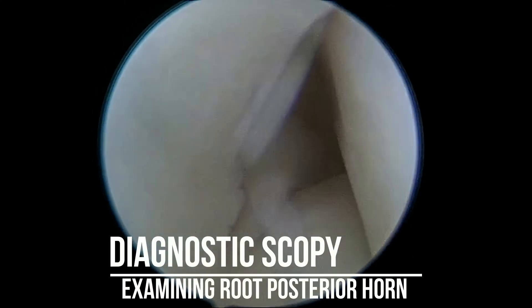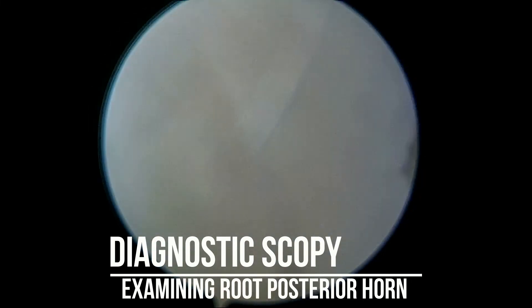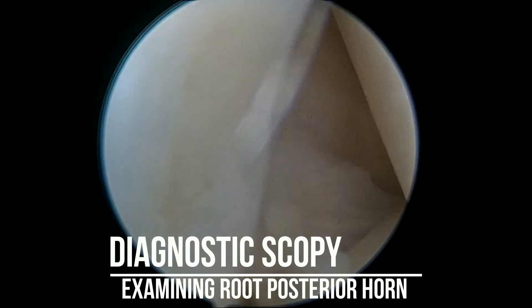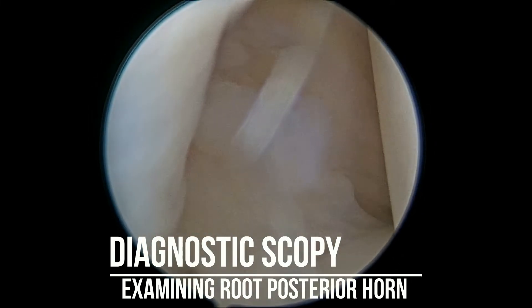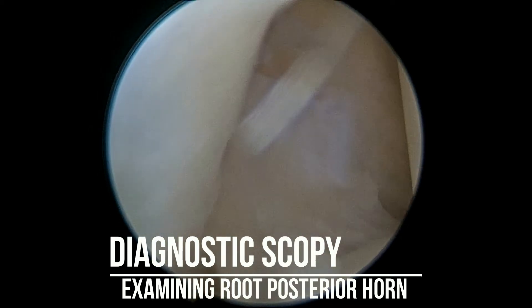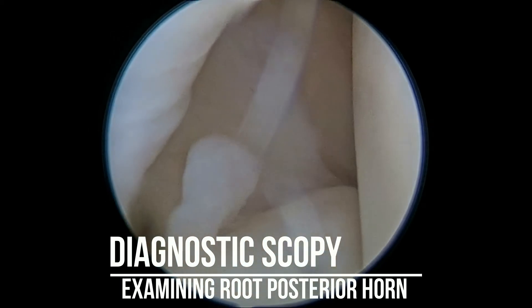Diagnostic arthroscopy also involves examining the posterior horn root for any tear. Since the tear was in the medial meniscus posterior horn, the root is essential to be checked. Here it shows a normal root.